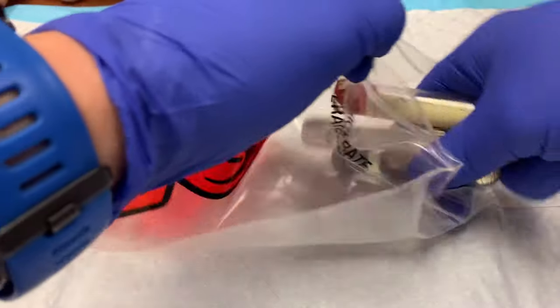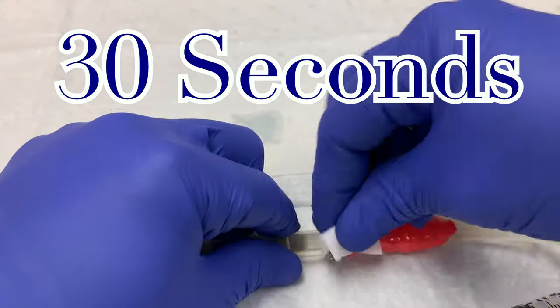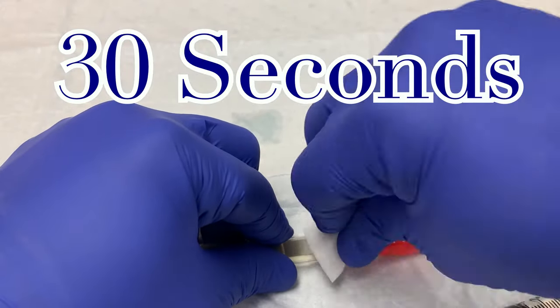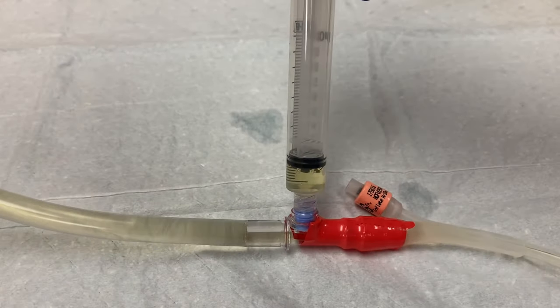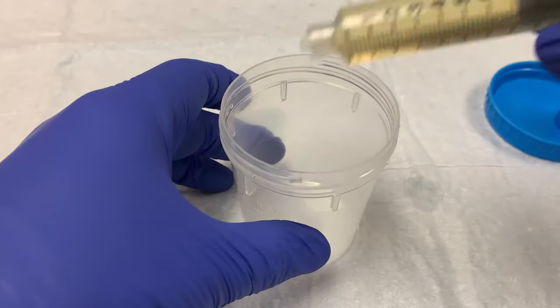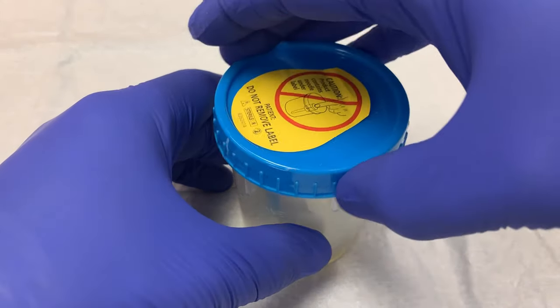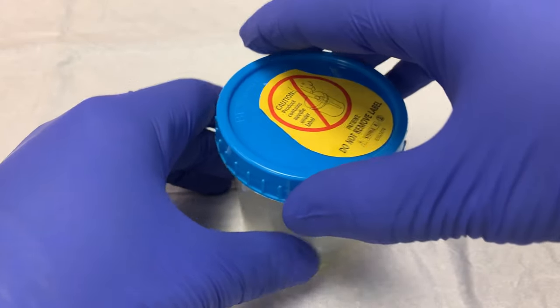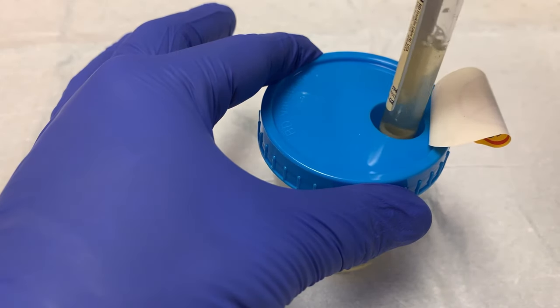The other method is to draw the urine from the catheter into a syringe. Clean the port for 30 seconds with alcohol or chlorhexidine and attach the syringe. Position the urine under the port and draw up the sample. You will need more than 10 cc's of urine, so you will either need to clean the port again and draw up another 10 cc's, or use a 30 cc syringe if available. Empty the syringe into the specimen cup, being careful not to touch the inside of the cup with the syringe. When the urine is in the cup, screw on the lid — the straw should be below the urine level. Peel back the yellow sticker to reveal the port and collect your samples in the same order as previously described.